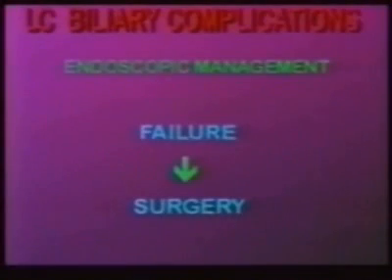Failures of preliminary joint radiologic endoscopic approach are managed by surgery, as shown in this case. To date, 3 successful radiologic endoscopic rendezvous have been completed out of 5 biliary tract transections referred to our center.